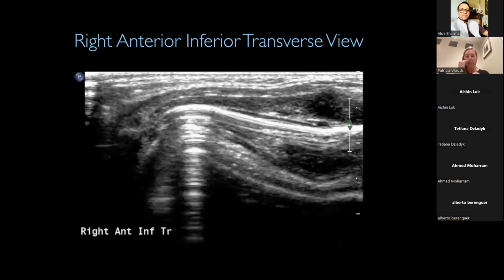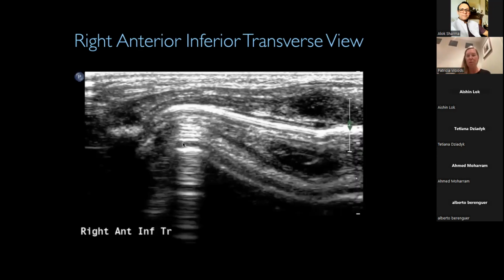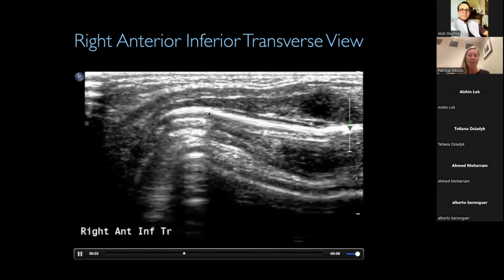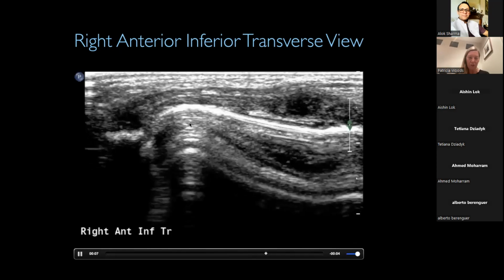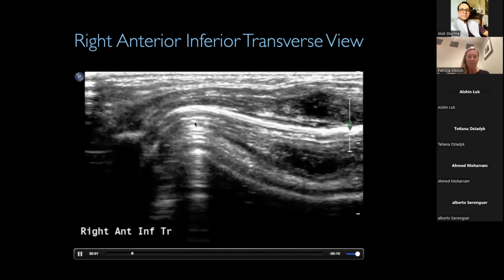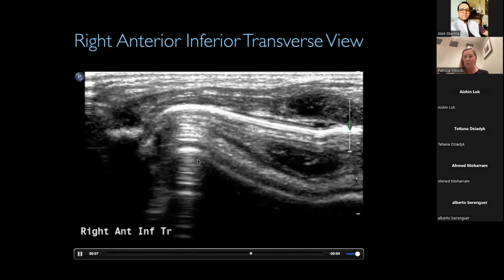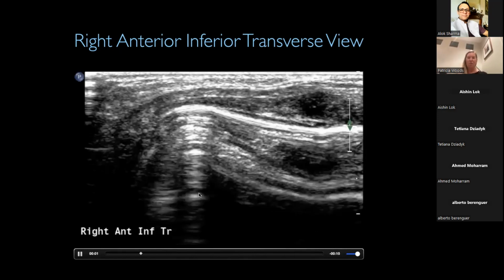Okay, you might observe a mirror-like artifact. You can see the rib up here above the pleural line and a suggestion of a rib coming below. But this thinly defined pleural line and this almost bounce-like quality, geometric sort of shape that you get with air leak, very strong A lines that don't really fade so quickly as you go through with depth. And I get this sort of feeling of bounce here and recession.